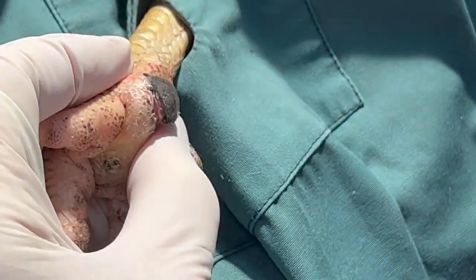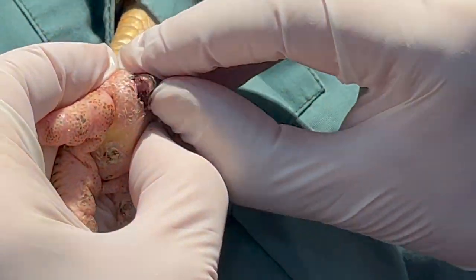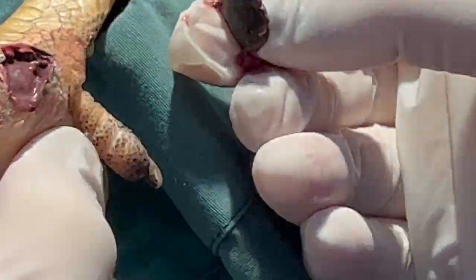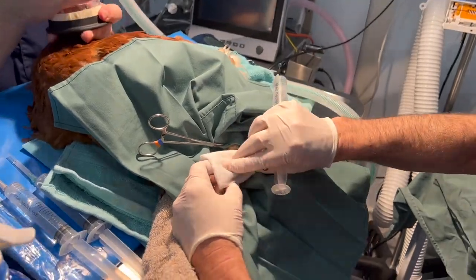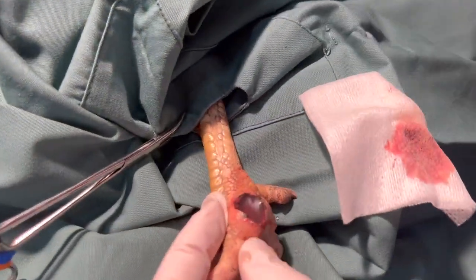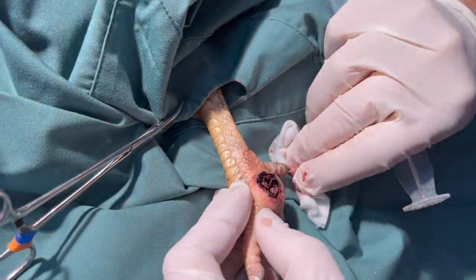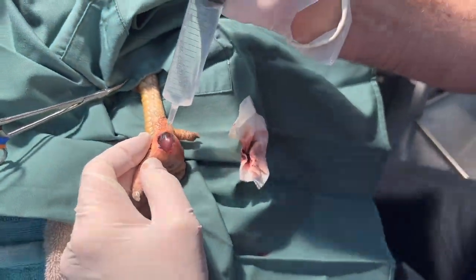So this is all dead tissue and you can actually start seeing the pus coming out now — that is pus, that's what bird pus looks like. It's a putrid smell, it's so toxic. You can just see the dead tissue; it's quite a hole, it's messy. Before we get bleeding we really want to clean it out as best we can.